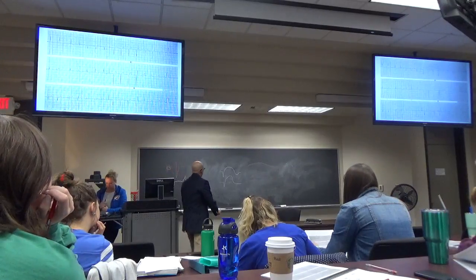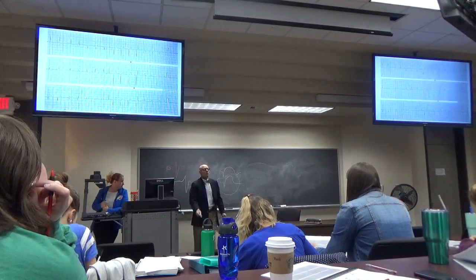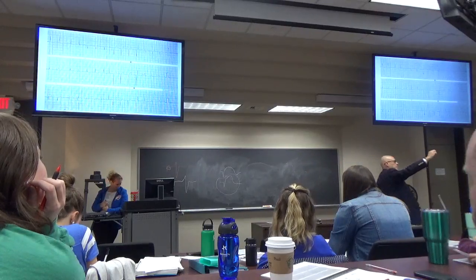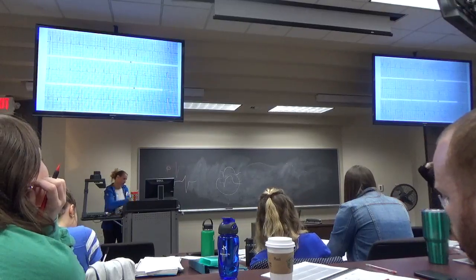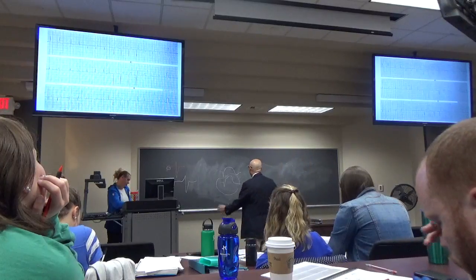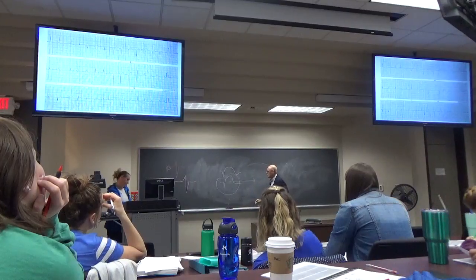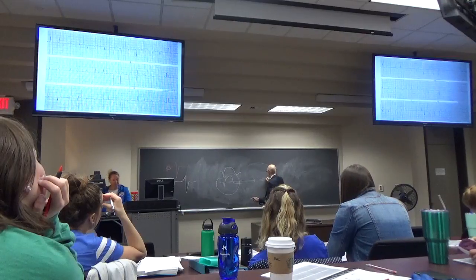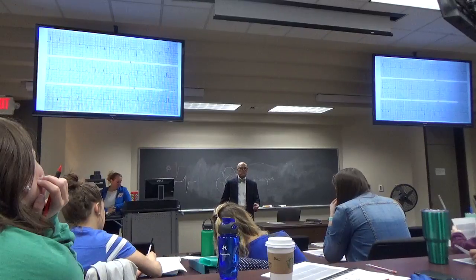Yeah, so we haven't talked about this, but this finding where you have a Q wave and the J point, the place where the ST segment begins, which is called the J point. When the J point is elevated off the baseline and the T wave is upright, that's probably more likely to be an aneurysm of the left ventricular wall.